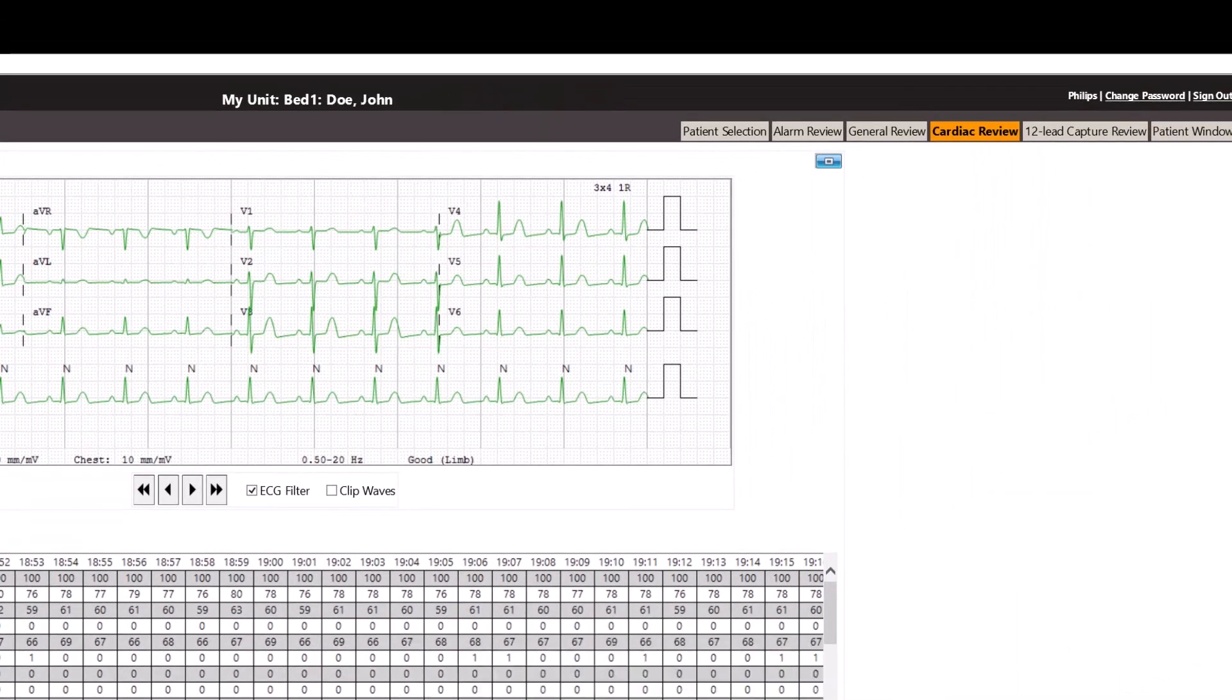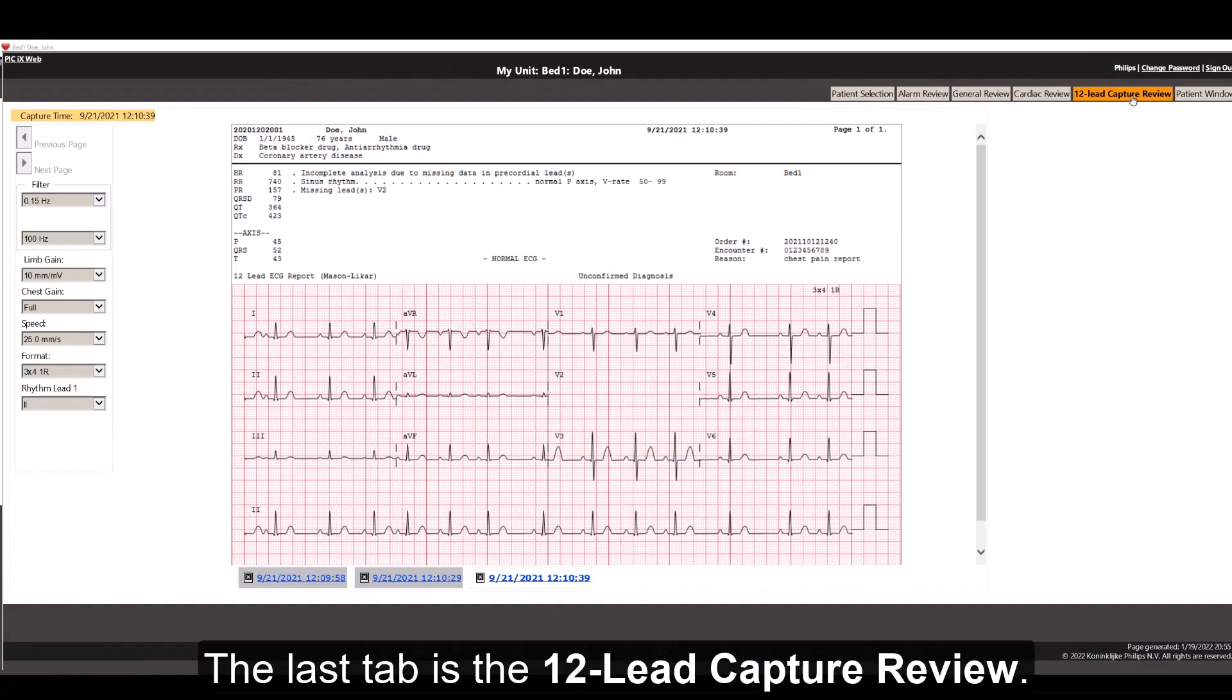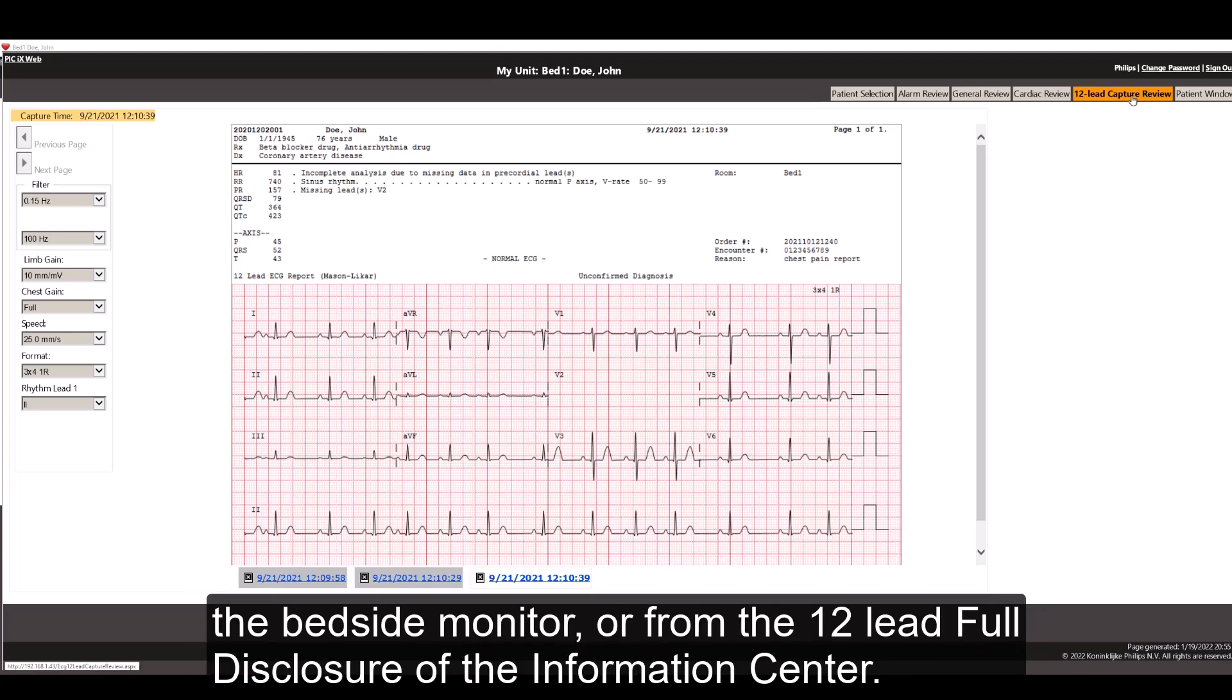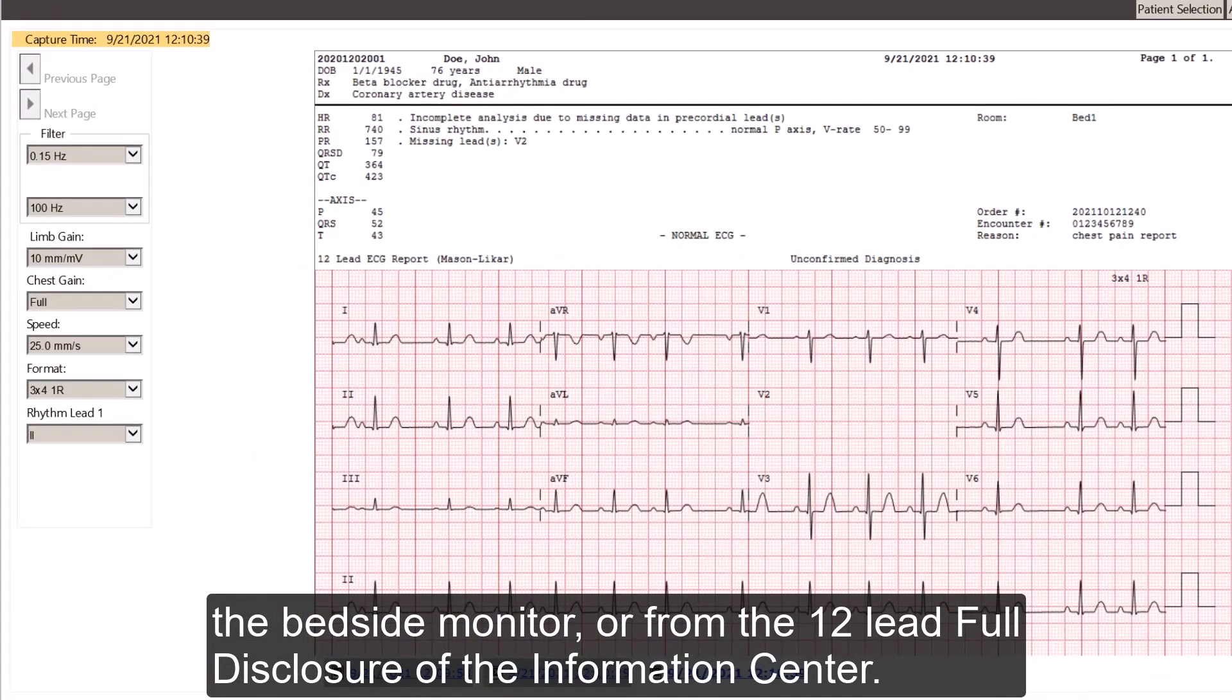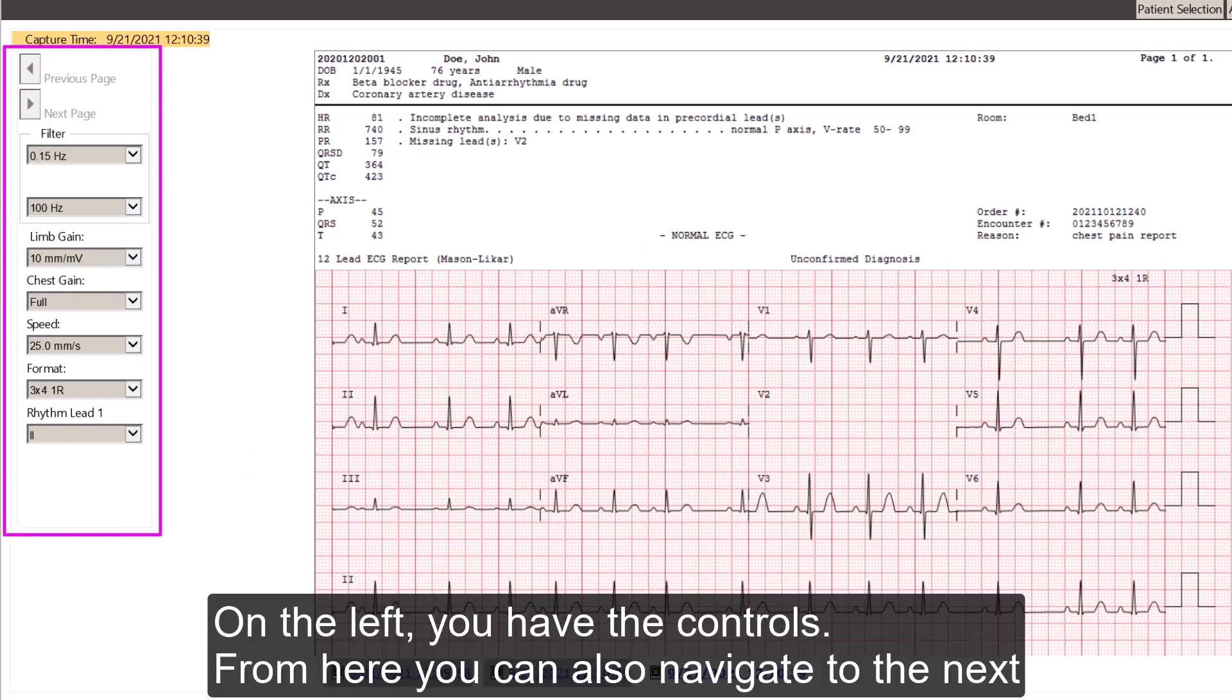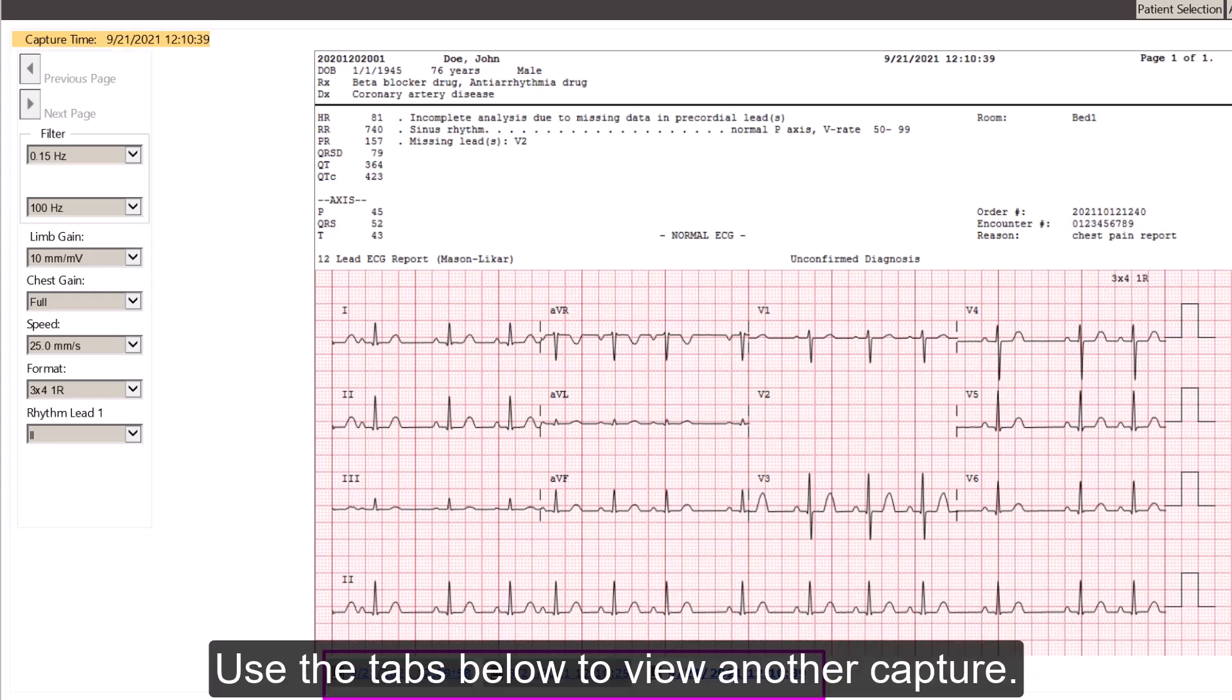The last tab is the 12 Lead capture review. The 12 Lead ECG capture review allows you to review all diagnostic captures done at either the bedside monitor, or from the 12 Lead Full Disclosure of the Information Center. On the left, you have the controls. From here, you can also navigate to the next and the previous page if the ECG report is a multi-page document. Use the tabs below to view another capture.